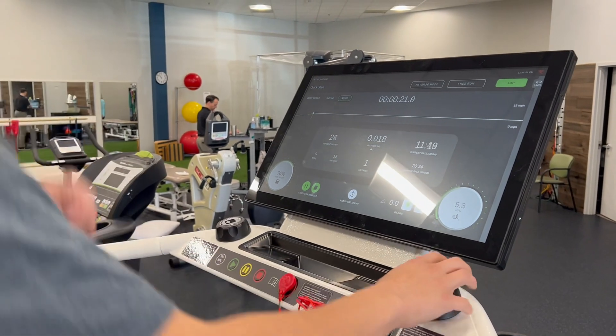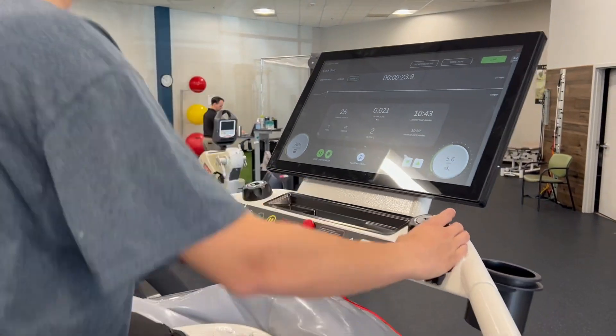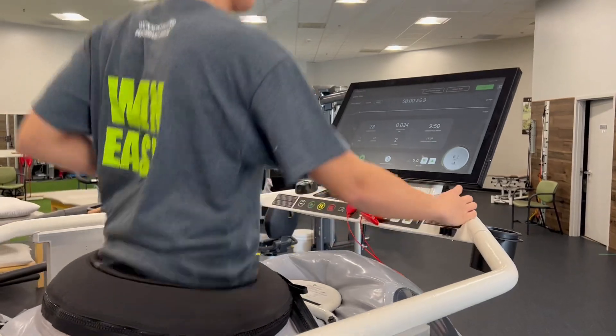Quick setup and calibration that gets our athletes moving without an extended setup process is another big advantage. We hope you enjoyed this Cooltech Spotlight and that your patients can improve their gait, their mileage, and their rehabilitation for lower extremity injuries even without increasing load. Enjoy!